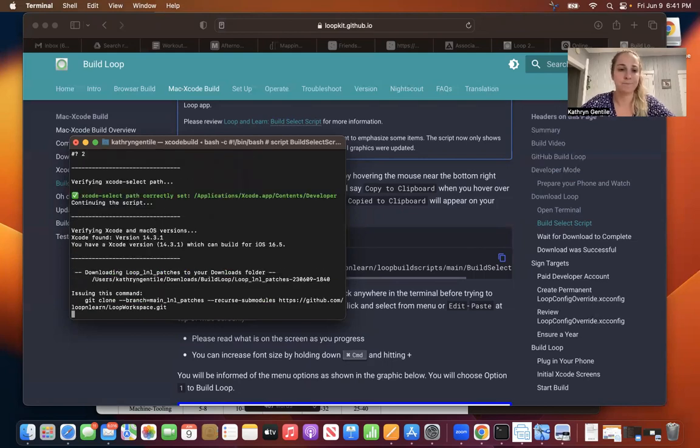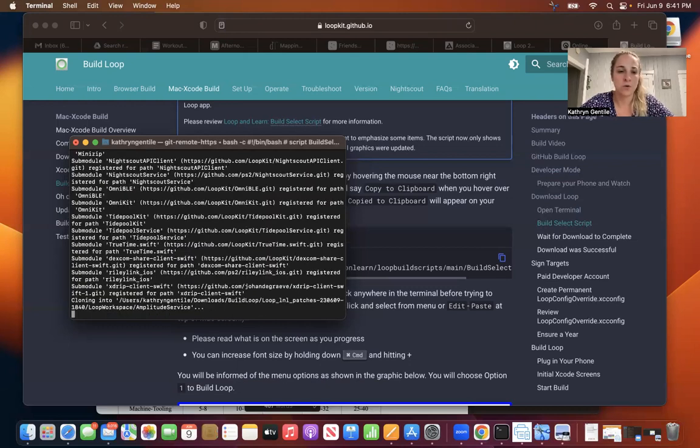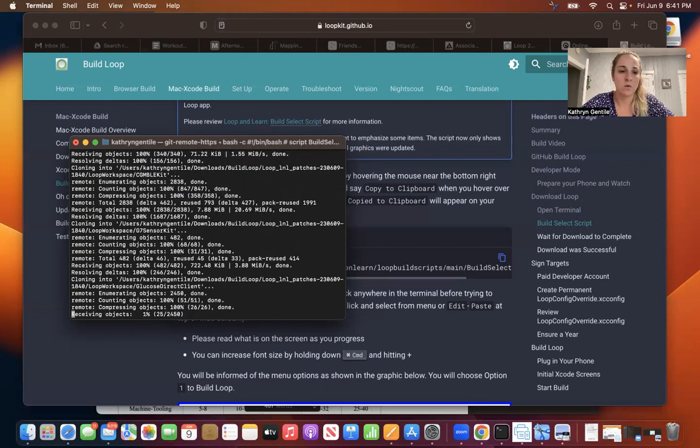With that being said, now it's gonna run through the whole downloading all the code. So we just have to wait.